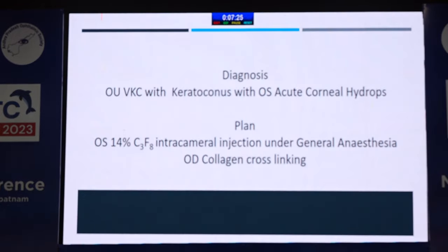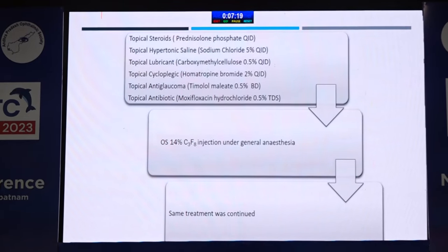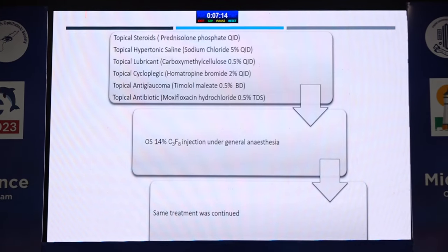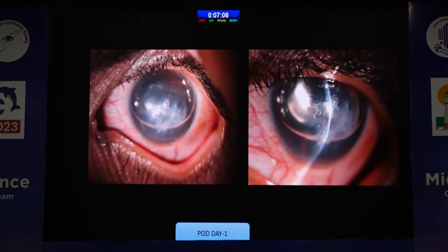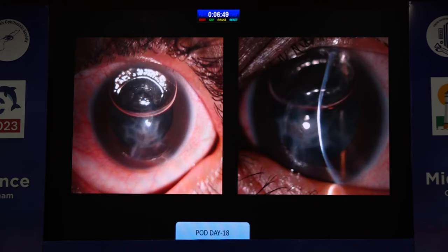We planned left eye 14% C3F8 intracameral injection under general anesthesia, and right eye cross-linking on a later date. Topical steroid, hypertonic saline, lubricating drops, cycloplegic, anti-glaucoma, and antibiotics were started. Isoexpansile concentration of C3F8 was used and the anterior chamber was filled up to two-thirds. Post-op day one image shows the AC filled with two-thirds gas, with some gas bubbles trapped in the stromal lamella due to the large Descemet membrane tear. By post-op day 18, there was complete resolution of corneal edema with corneal scarring.